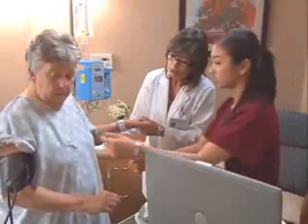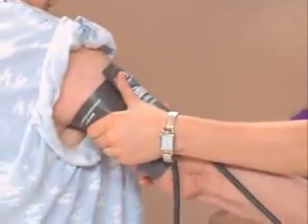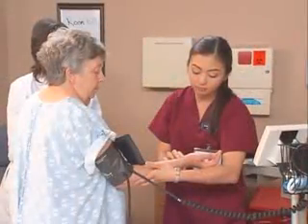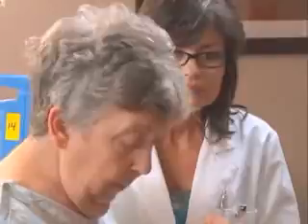Are you still okay? Are you all right? Yes, I'm okay. All right, double check the cuff, Rose. Okay, looks good. It's going to get a little tight, and I'm going to take your blood pressure and pulse again. Great. Are you okay? Let's get you back into bed.